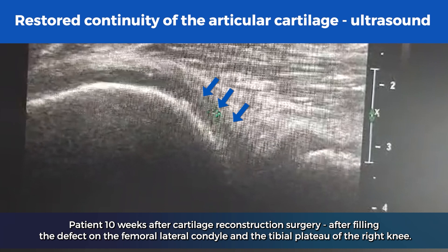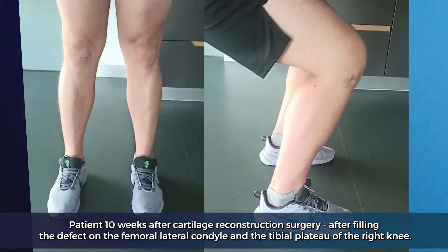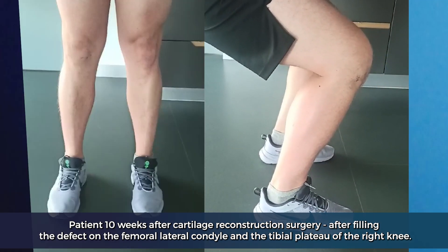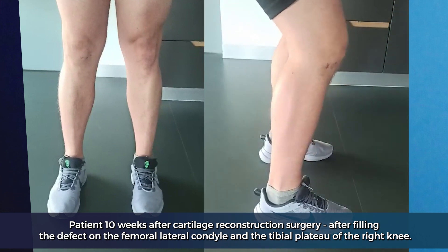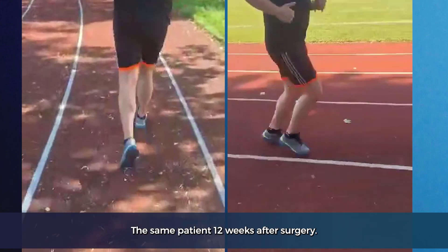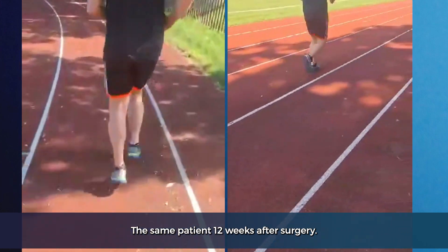The patient, 10 weeks after cartilage reconstruction surgery, after filling the defect on the femoral lateral condyle and the tibial plateau of the right knee. The same patient 12 weeks after surgery.